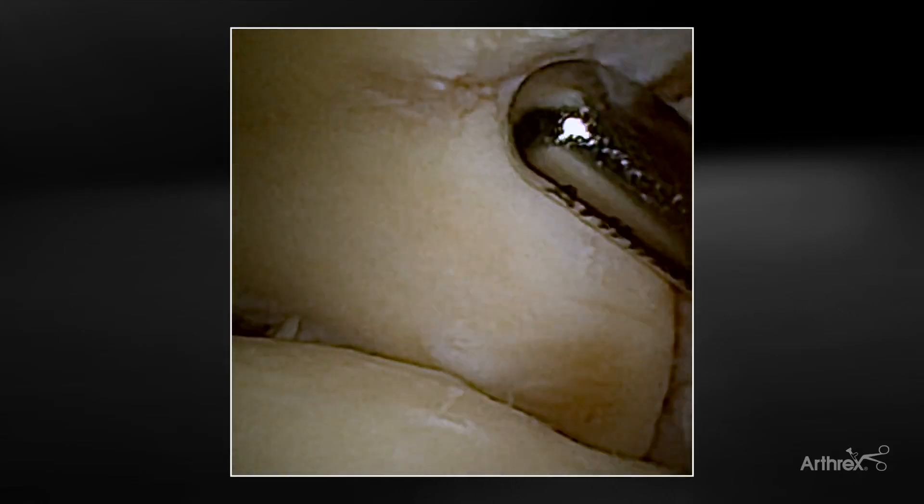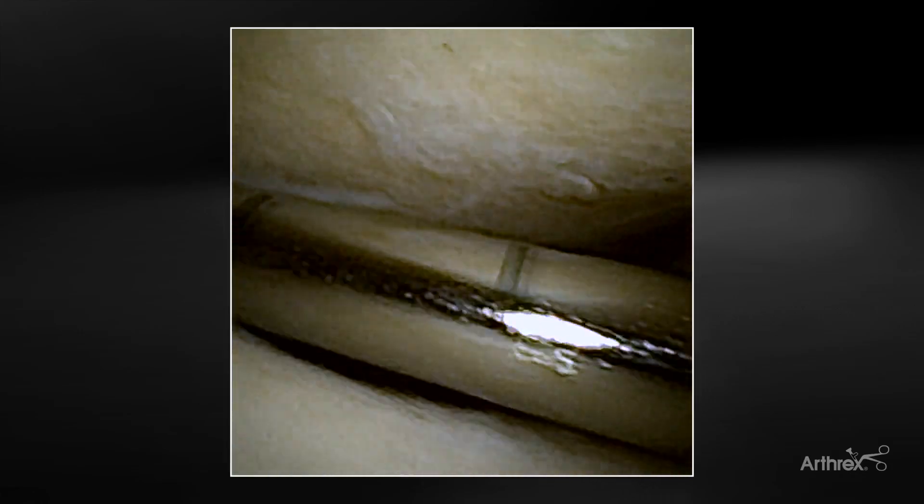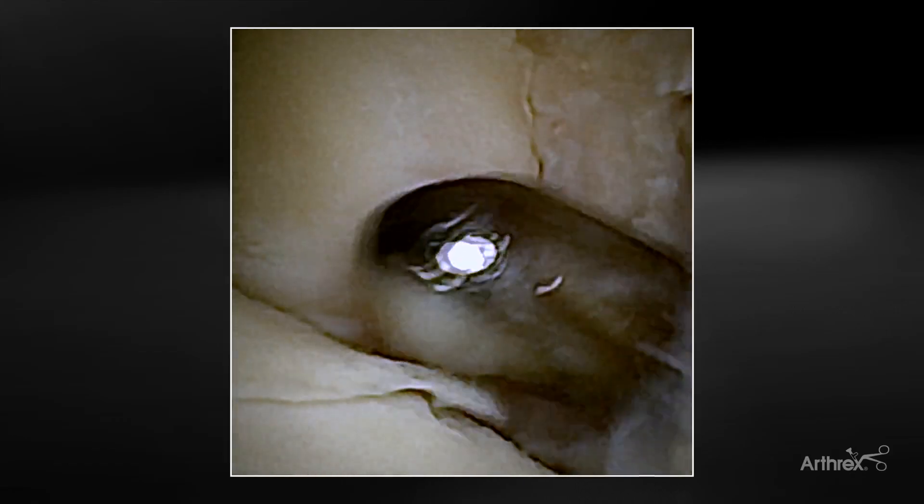You'll see papers starting to come out — we have data we're publishing on this. We actually validated this in the lab in the last couple of months. This is the medial drive-through sign, and you can sometimes just take the shaver and push and see the medial side open up at times. I wanted to highlight some of the diagnostic things: if you're not scoping your ankle stabilizations, you're missing out on a lot of pathology. Document the syndesmosis as intact and stable, osteochondral defects, frequent things we encounter in ankle instability, and the deltoid drive-through sign — negative or positive. If it is positive, I encourage you to go ahead and repair it. We use a couple of fiber tacks typically here. The new DX knotless fiber tacks work well to do a medial deltoid repair.